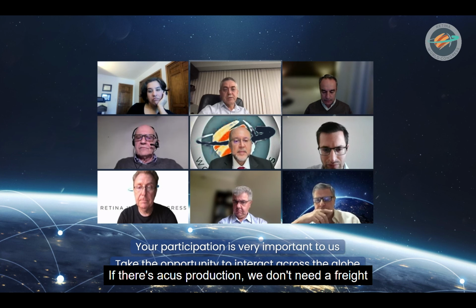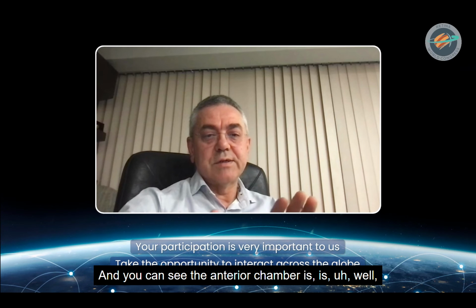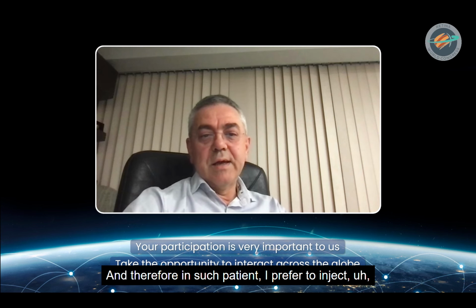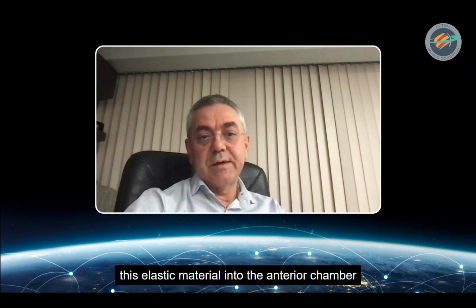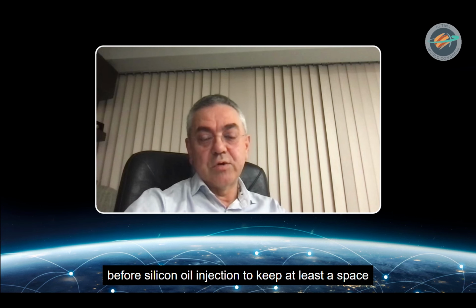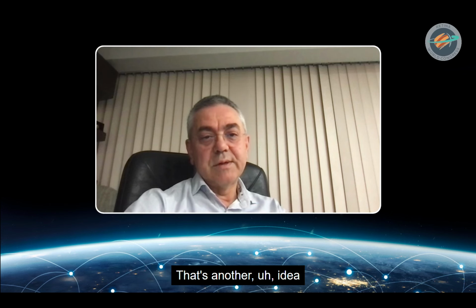If there's aqueous production, you don't need to be afraid because the aqueous comes into the anterior chamber, and you can see the anterior chamber is well formed. And therefore, in such patient, I prefer to inject viscoelastic material into the anterior chamber before silicone oil injection to keep at least a space during the early recovery period and prevent the anterior chamber from collapsing. That's another idea that I can suggest in chronic hypotony patients.